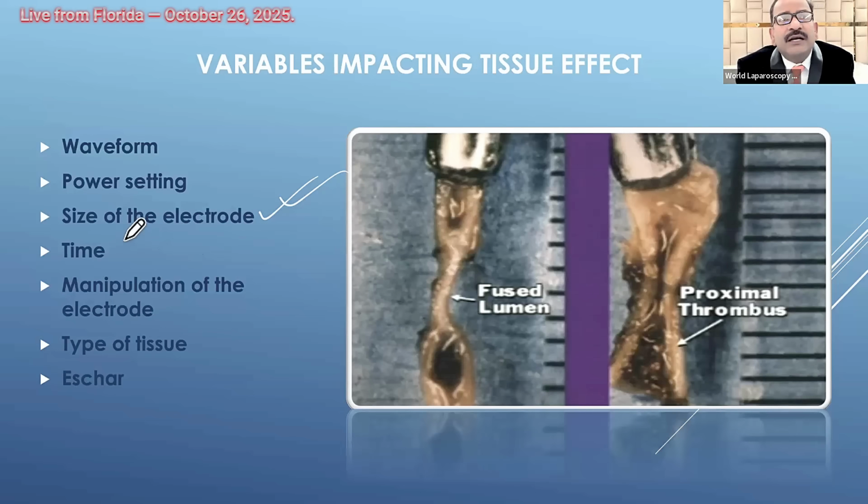Then time, as we have already seen, we should not go more than 3 seconds maximum in one go. After 3 seconds, you should open the jaw, take it out, and again catch it. Why open the jaw and take it out? Because it should not stick with the tissue. So timing is also important.